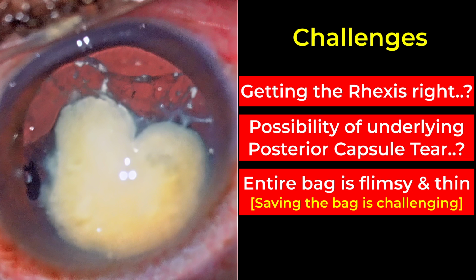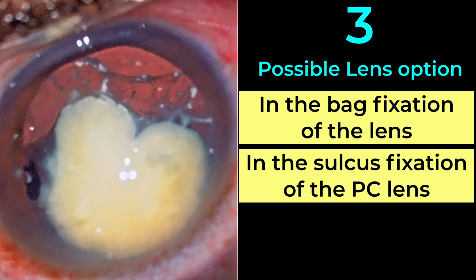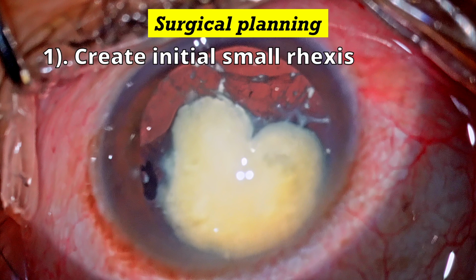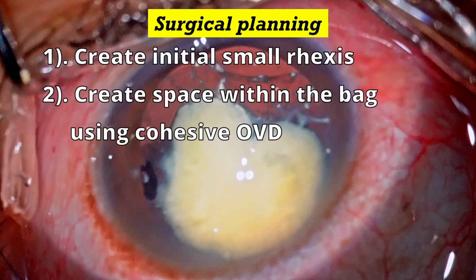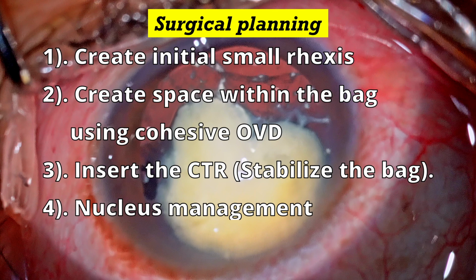For that reason, I have kept my iris clip lens ready after calculating the required A constant. So I'm ready with three possible options: the in-the-bag lens, the sulcus lens, and the iris clip lens. My surgical plan is to try a smaller initial rhexis, then try to create space within the bag using cohesive OVD. If I'm able to create space in the bag, then maybe I will introduce a CTR to stabilize this area of zonular weakness and then deal with the nucleus.